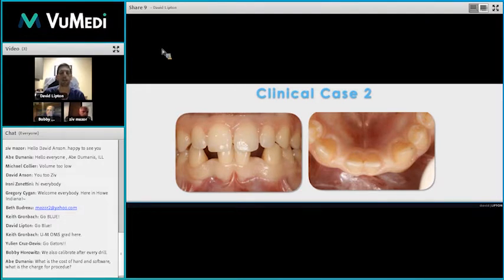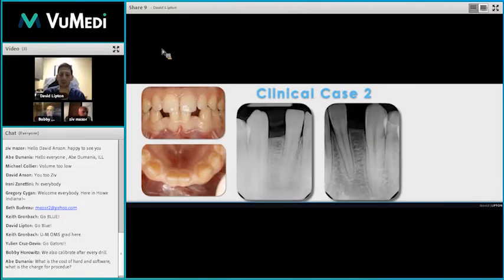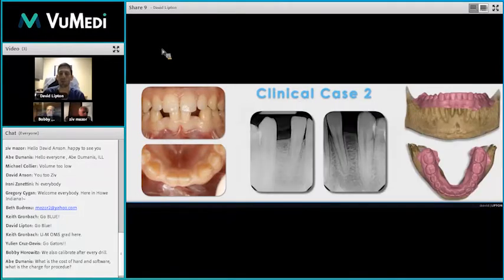But he finally convinced his parents to allow him to get 2 implants placed. Now, when we look radiographically, we got a really, really narrow space, and this is after orthodontics, and this is all our orthodontist could move these teeth in line. So we did an optical scan with the digital wax up and merged the STL file with our CBCT, and we started planning the surgery.